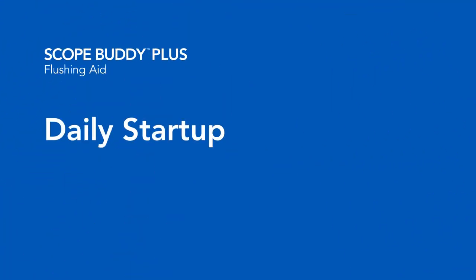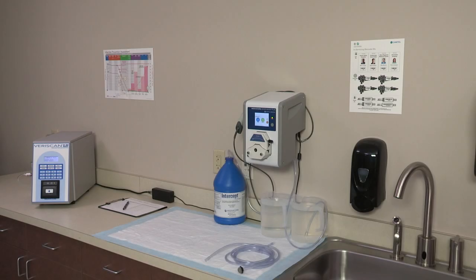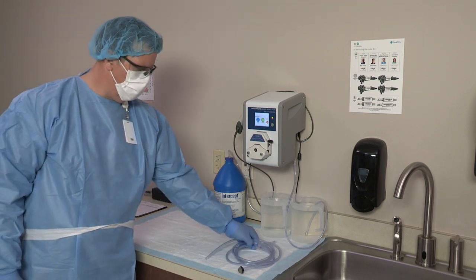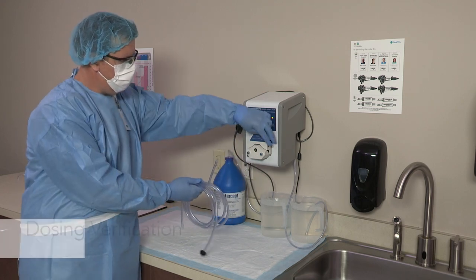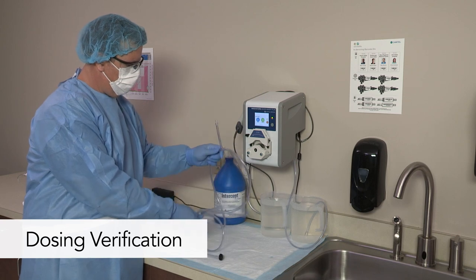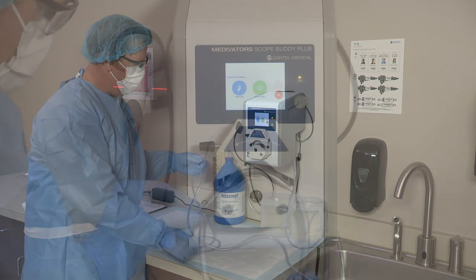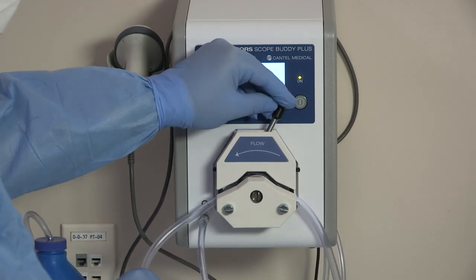Let's walk through the daily startup tasks. The dosing system should be verified daily to ensure it is within specification. If the dosing verification fails, the dosing calibration must be performed, followed by repeating the dosing verification procedure to ensure the dosing system is calibrated correctly. To perform the dosing verification, install the 24-hour pump tube — it should not have any fluid in the tubing. If a new detergent bottle is being installed, first prime the detergent in-tube. Enter manual mode from the home screen and press OK to advance.